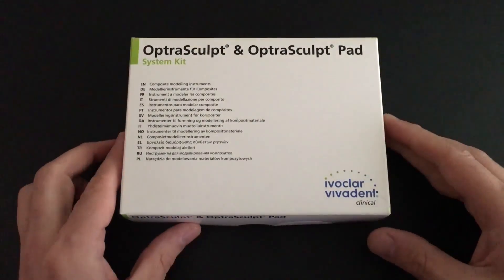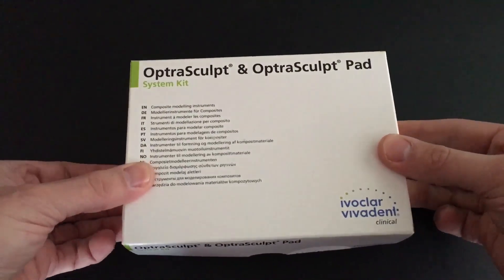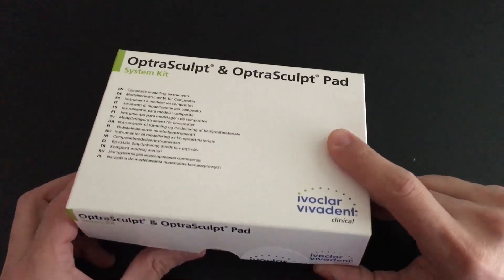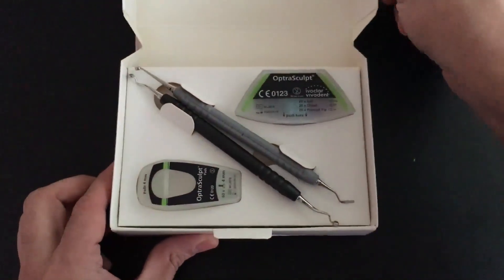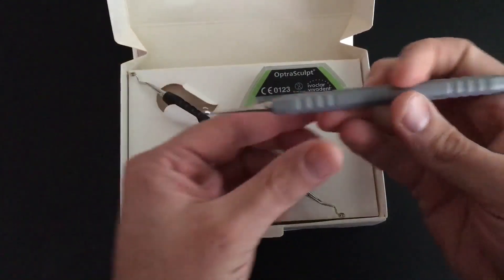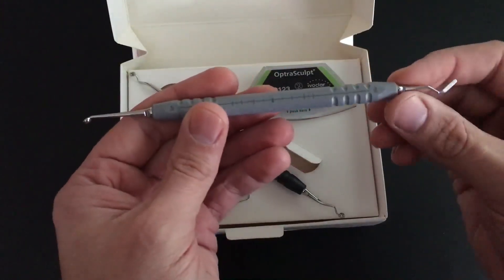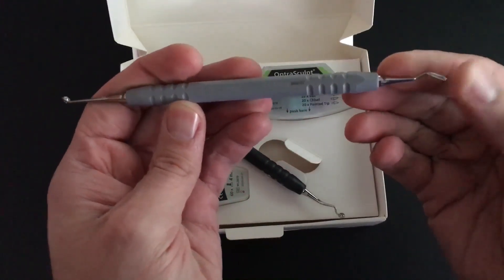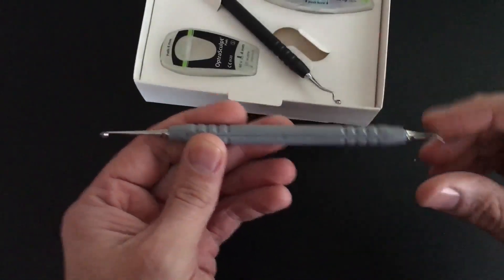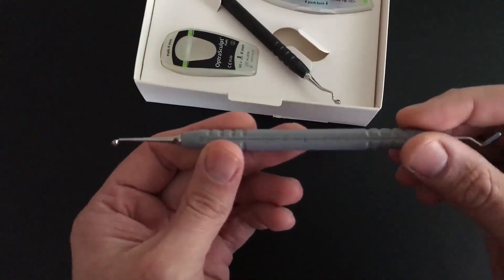Here we are with the OptraSculpt next-generation and OptraSculpt Pad instrument by IvoClar VivaDent, and these are great instruments for placing direct resin composites. We've reviewed the OptraSculpt Pad before — this is a great instrument for anterior composites, for pushing and padding your composite around. As you can see, it's got a nice thin composite instrument on this side, and it actually has a little ruler with some golden proportion markings that really helps for determining widths of teeth — centrals and laterals and whatnot.